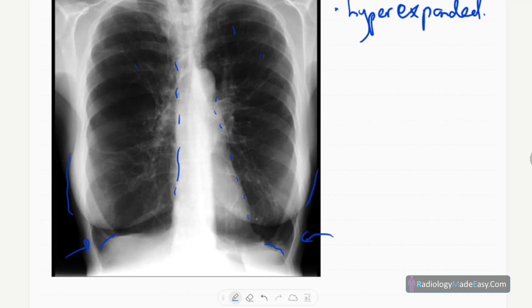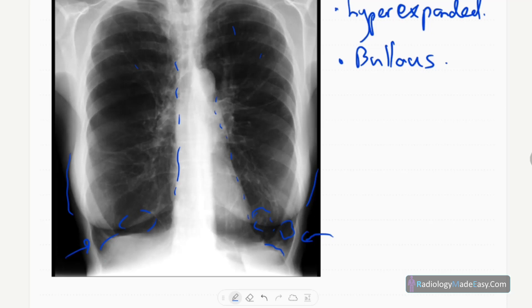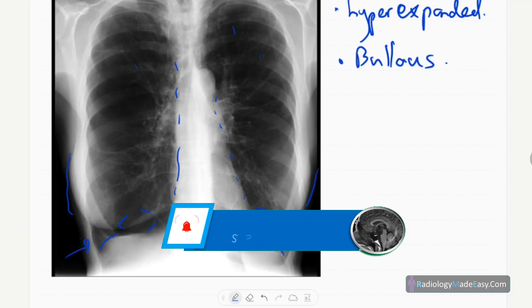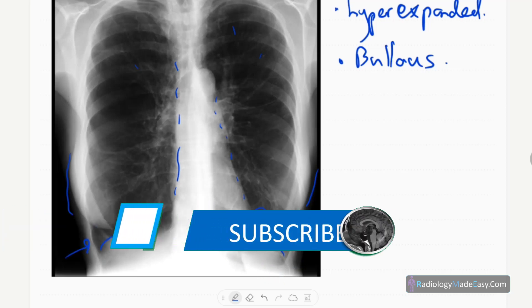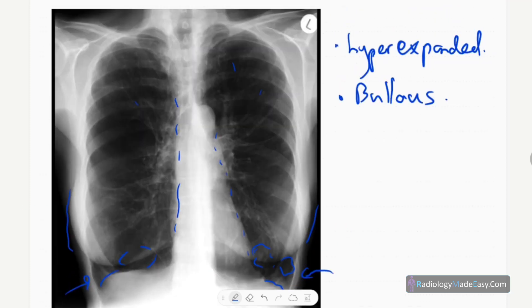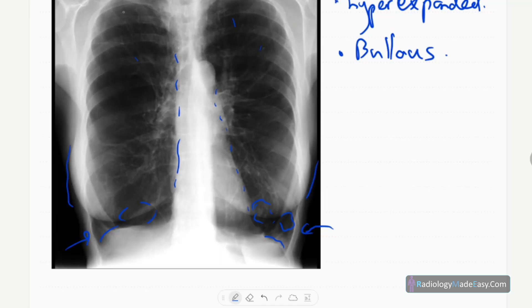There are lucencies in the lower zones of both lung fields — these are likely bullous changes in both lower zones. There are no mass lesions, no evidence of pneumothorax, and no pleural effusions — no complicating features. There are also no consolidations on this X-ray. The trachea is central and there is no obvious bony pathology.